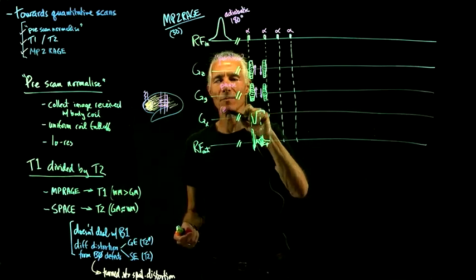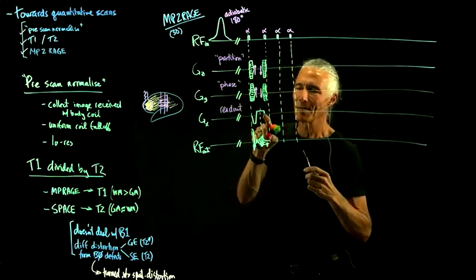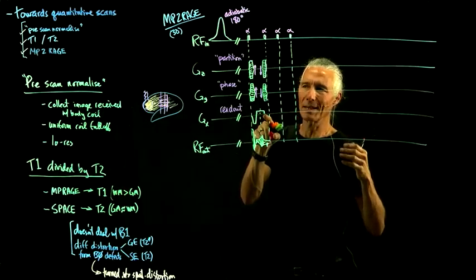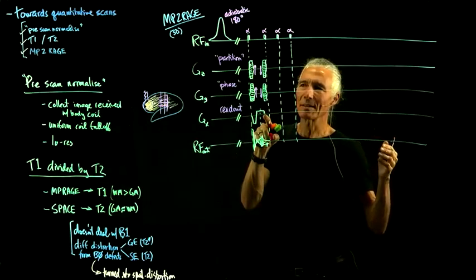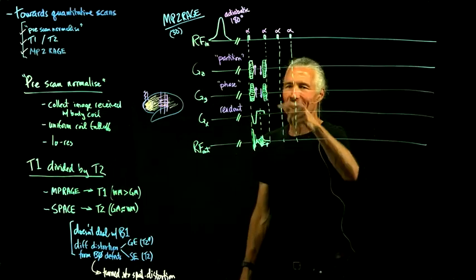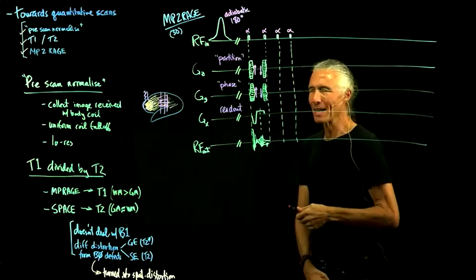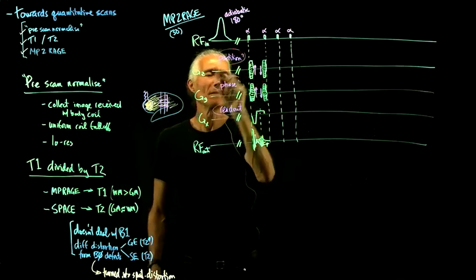So we didn't fix the readout. So we left ourselves all the way off to the right side of k-space, and that's sort of like spoiling it because you're wrapped up to 128 cycles of spin phase, and the signal is pretty small. But we fixed these to sort of save some of the magnetization in the other direction. So it's a motley sort of weird kind of pulse sequence with multiple things going on.